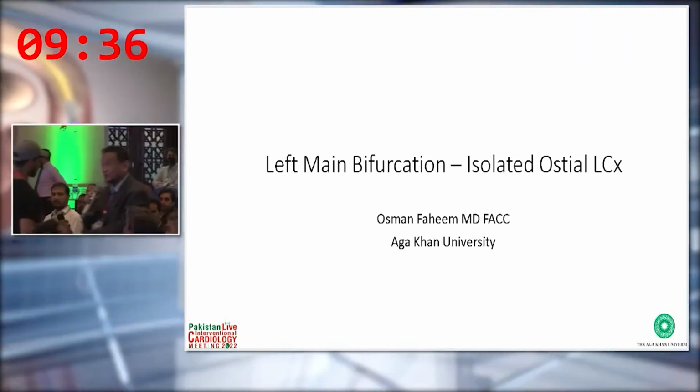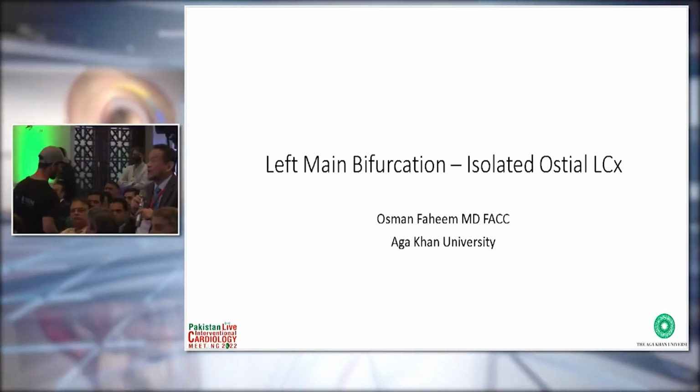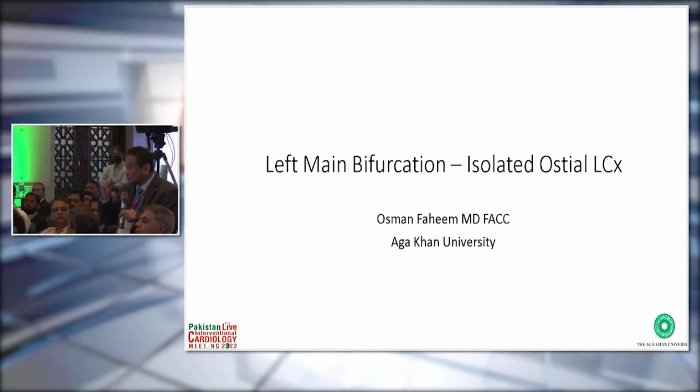Treat the lesion as soon as you can. How soon? Within a minute. With a sirolimus-eluting drug, probably you can do it in about 2 minutes, but 1 minute is key. So this is where vessel preparation is good. You must make sure that the guide, the wire, and so on are ready, and get it done as soon as you can.